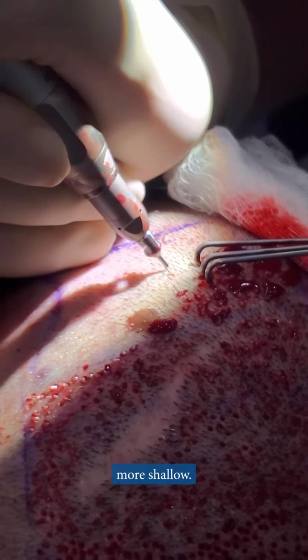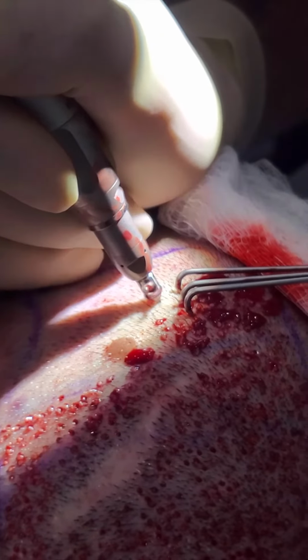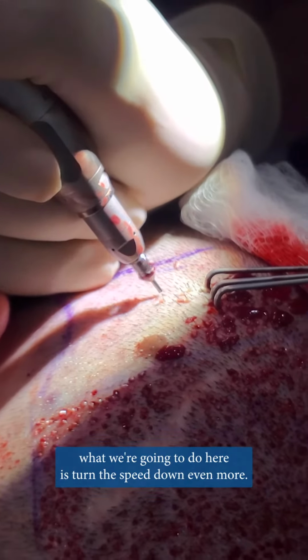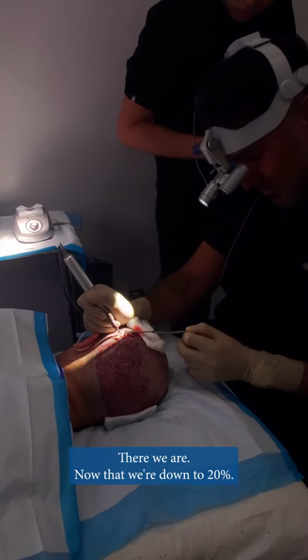more shallow, and you very gently feel the tissue. And actually what we're going to do here is turn the speed down even more. So we'll go down to 20. There we are. Now we're down to 20%.